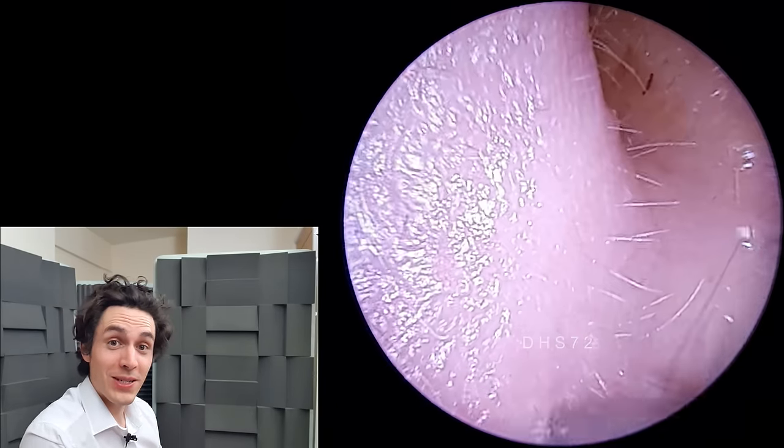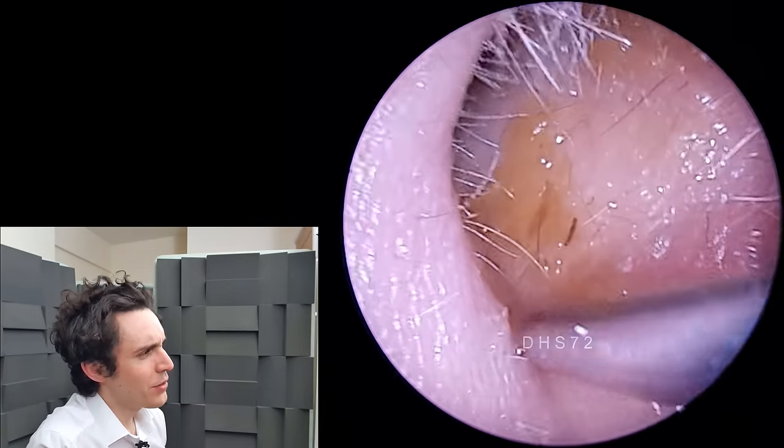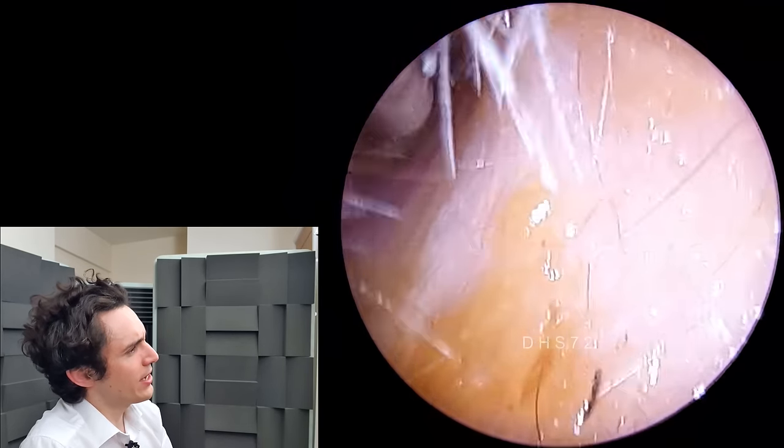Hi everyone, it's Connor here from Durham Hearing Specialists. I hope you're doing well, and welcome to another video. We've got a rather interesting wax removal here.